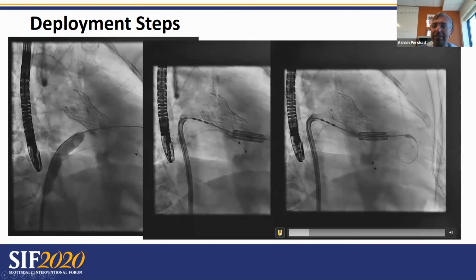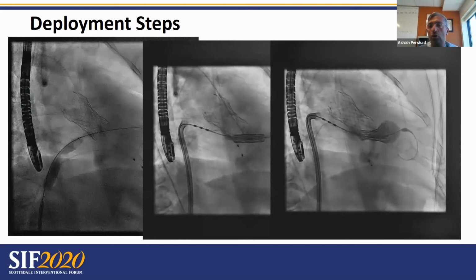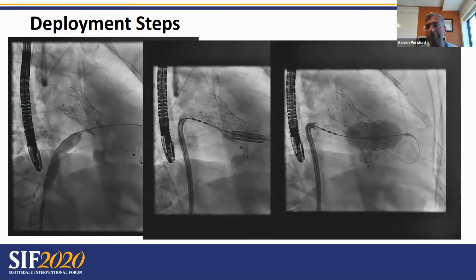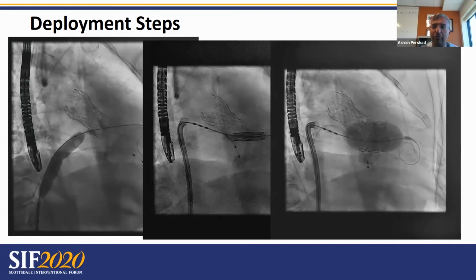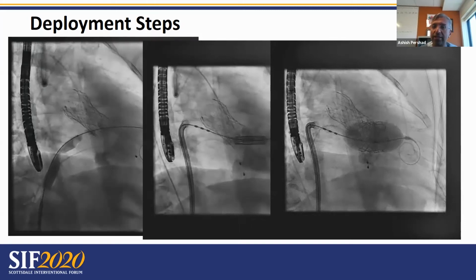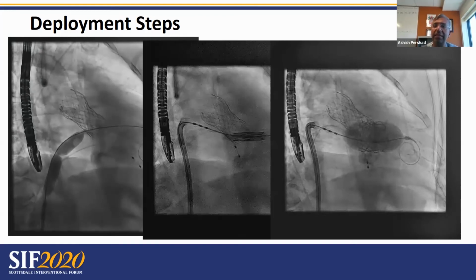We rapidly pace these patients. The deployment is slow, and you can see that our goal is to flare the Sapien valve with a 20% offset in the left atrium, such that you can get full expansion. Typically for a 29 valve, we add a few extra cc, usually 4 or 5 extra cc of contrast. And for a 26 valve, we'll typically add 3 extra cc. In this case, we had added 4 or 5 extra cc of contrast. The valve is fully expanded, as can be seen in the right panel.